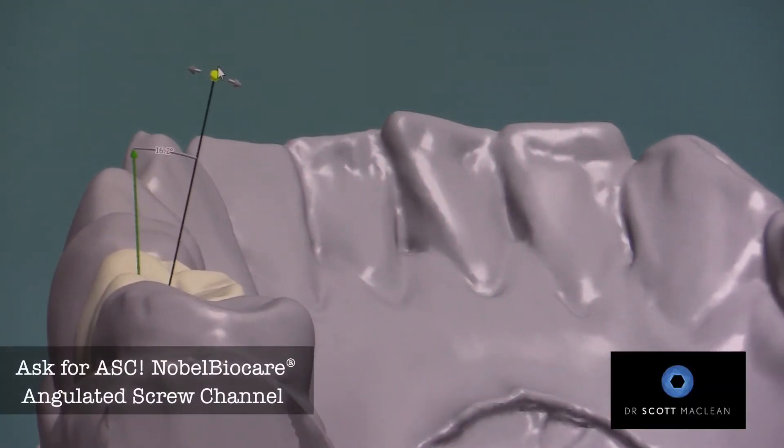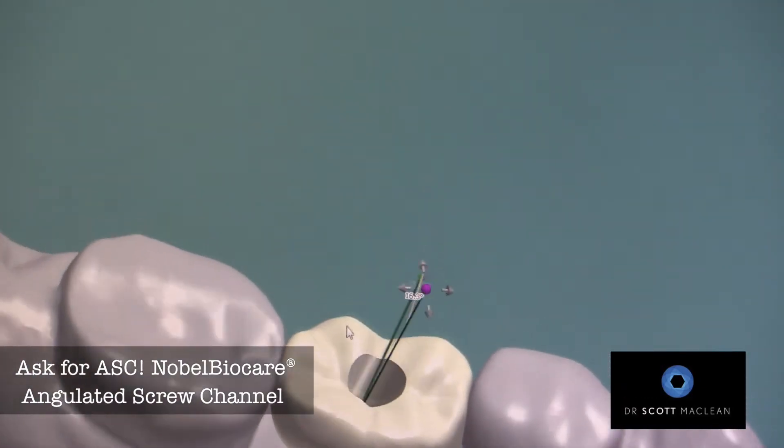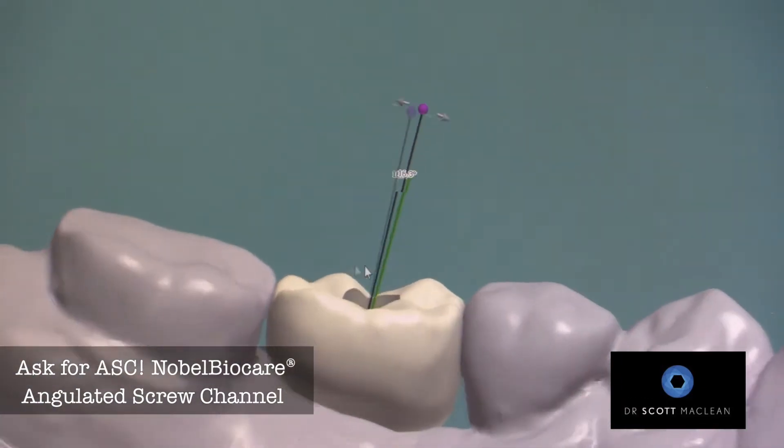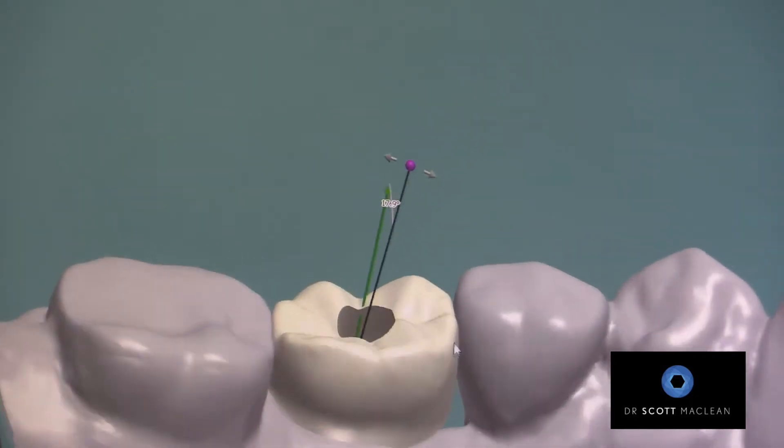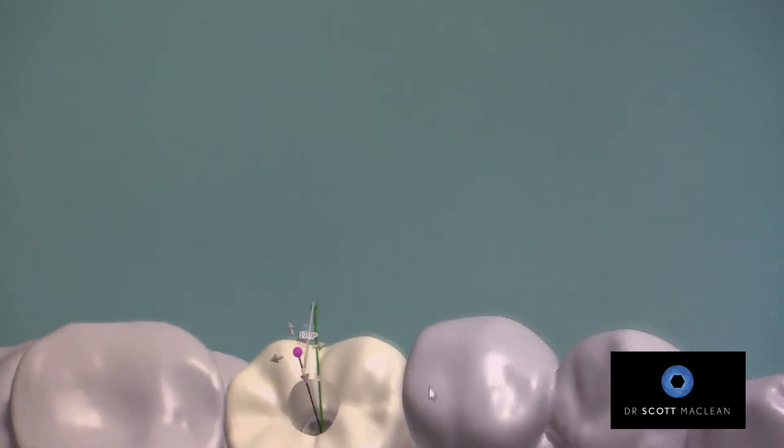So with the ASC or Angulated Screw Channel from Nobel BioCare, you can take the channel, tip it in the three-shape software. And then tip it back and create an angulated screw channel so that the channel is now going to be in the center of the crown.